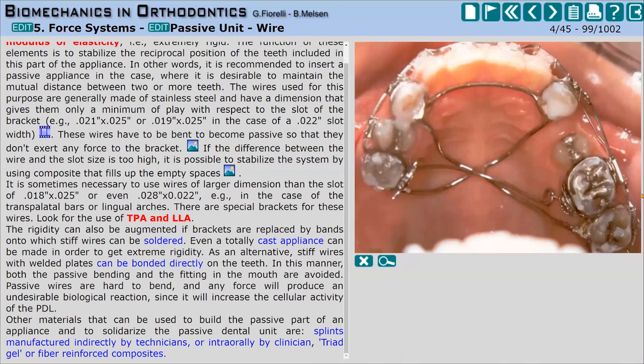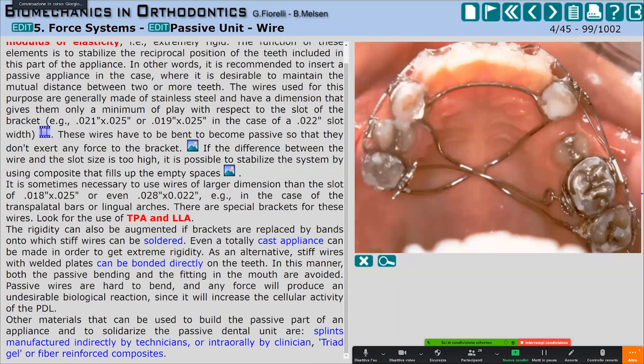So now in this case, we were having this tooth, and this tooth, and this tooth that were very rigidly connected by all the structure here. And you can add to this also some other wires here.